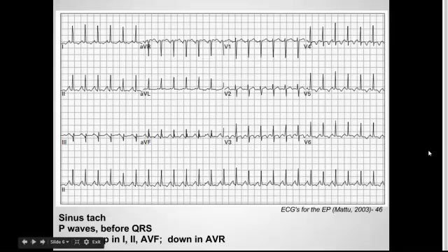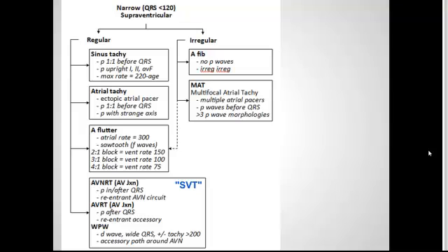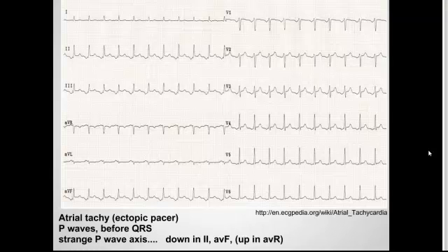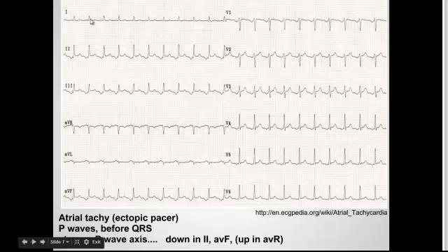Next is atrial tachycardia, which is going to be an ectopic atrial pacer. You're still going to have 1-to-1 P waves before your QRS, but the axis is going to be strange because it's coming from a different location. Here's the atrial tachycardia with an ectopic pacer — you again have P waves before each QRS, but looking at the axis: where it should be up in I, II, and aVF in sinus tachycardia, here you see it's down in II and aVF. You have a downgoing P wave and it's actually up in aVR — the opposite of sinus tachycardia.